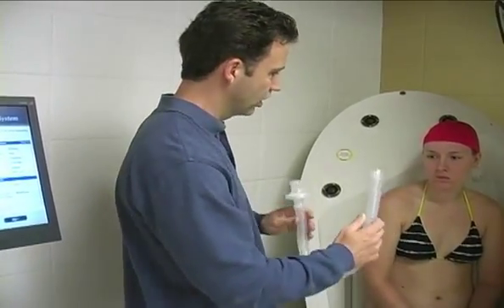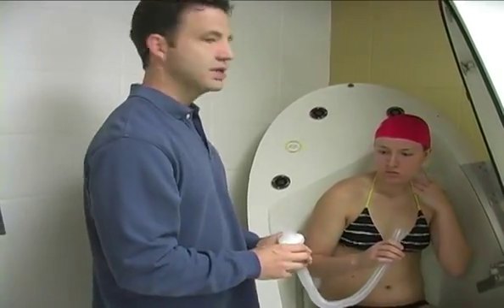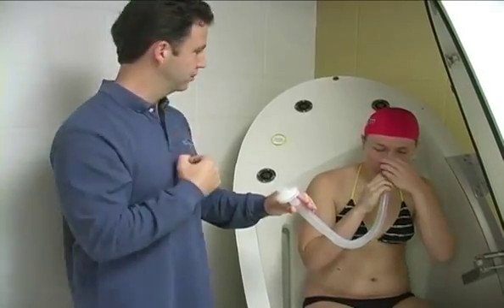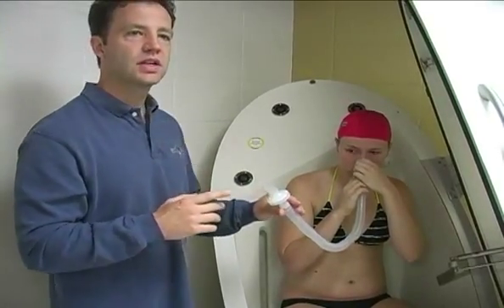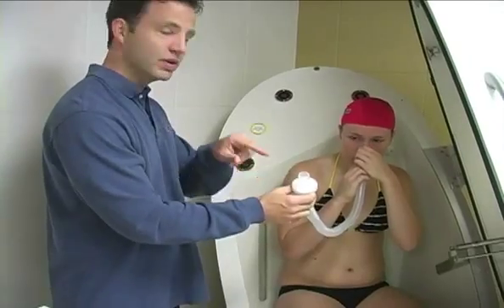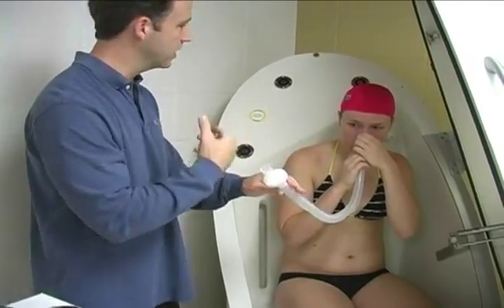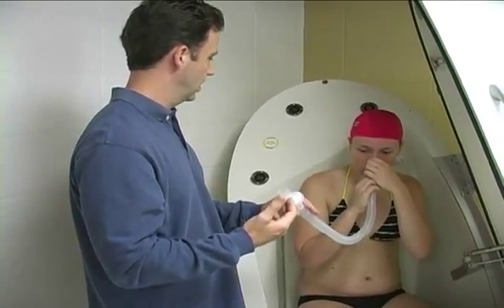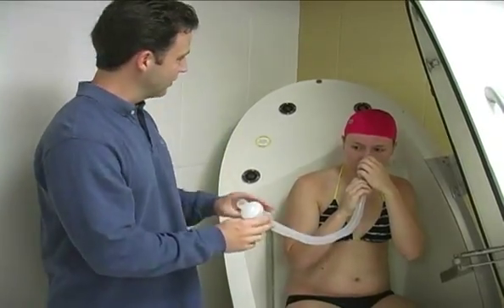So to demonstrate that, I'm gonna simulate what's gonna happen. So pretend on the computer screen, if you will, it says put tube in mouth. So put the tube in the mouth. What did she forget? Plug your nose. Yep, plug your nose. So she's gonna do that, and then she'll be prompted to prepare to huff. Don't huff yet. And then it's gonna say huff. But when it says huff, and I'll tell you in a second, the BOD pod is gonna occlude this valve. So there will be resistance. Right now it's free flowing. So when I do that, a shutter will occlude this valve, and I want you to then go, out, out, out, so 3 times, all right? So breathe normal, and huff. Good. Do you feel that resistance when I plugged it?